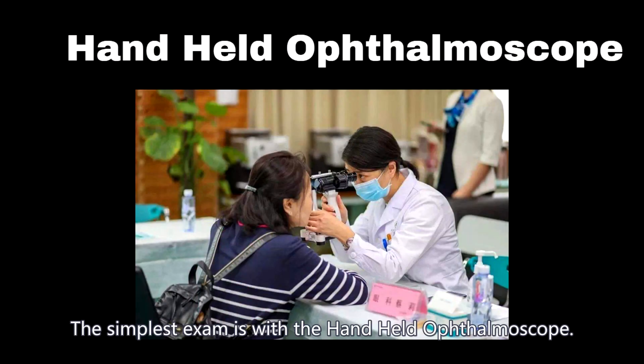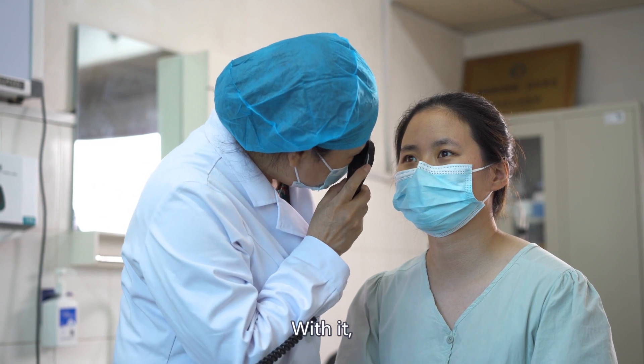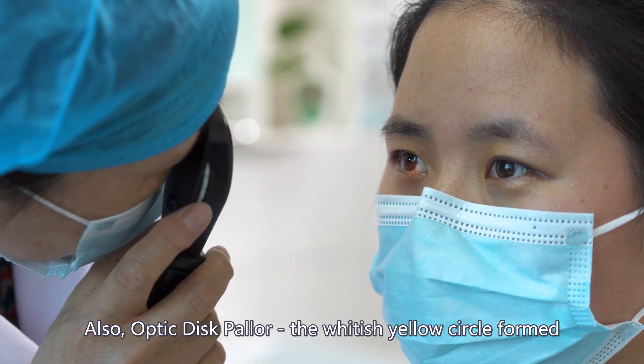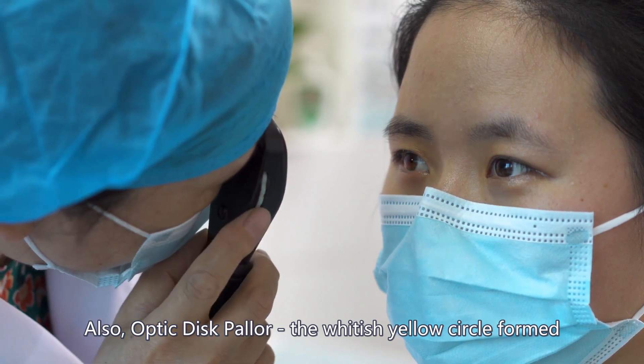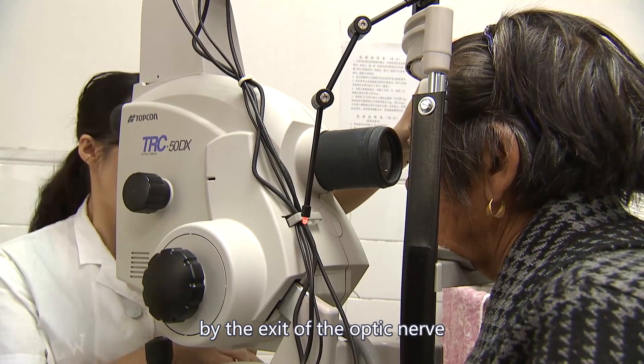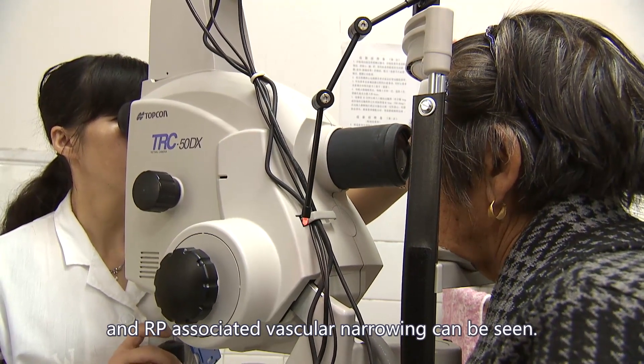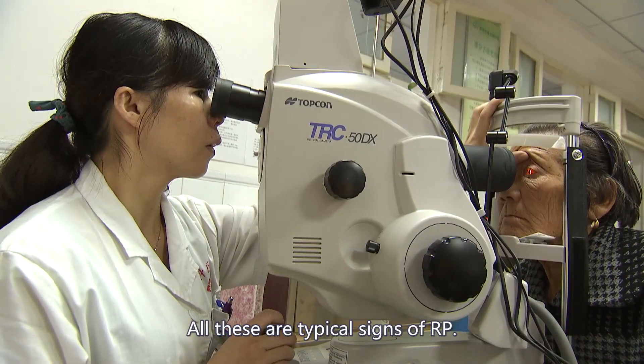The simplest exam is with the handheld ophthalmoscope. With it, the pigment can be visualized. Also, optic disc pallor — the whitish-yellow circle formed by the exit of the optic nerve on the back of the retina — and RP-associated vascular narrowing can be seen. All these are typical signs of RP.